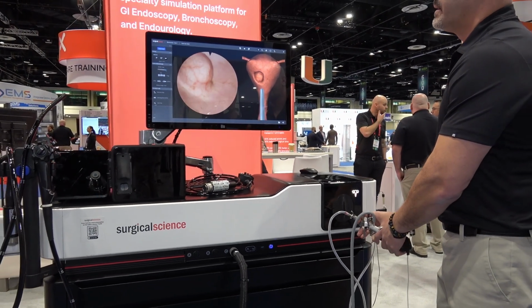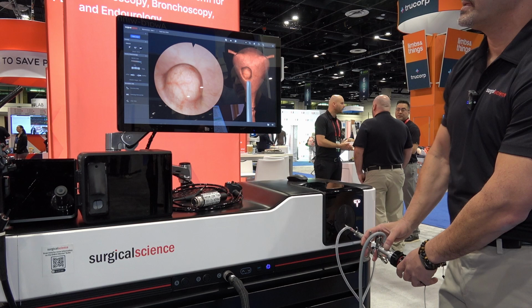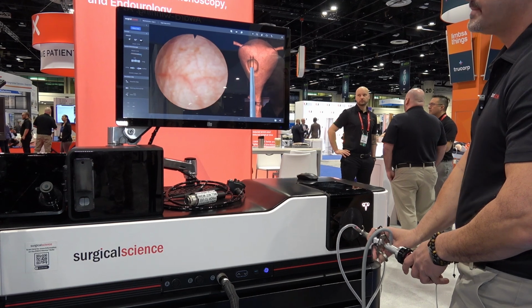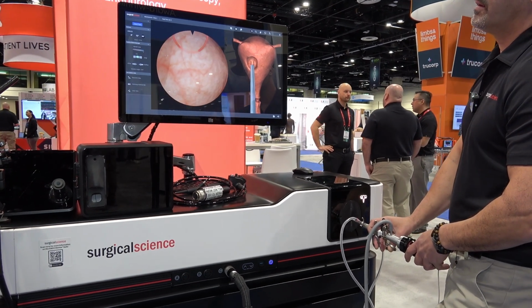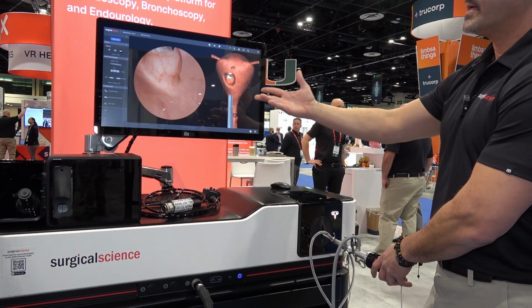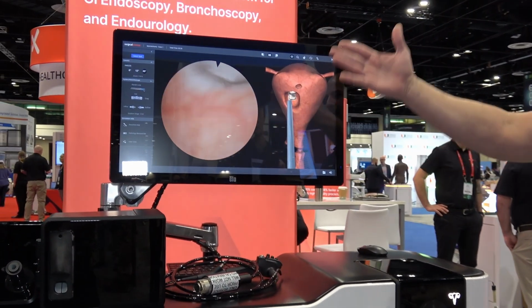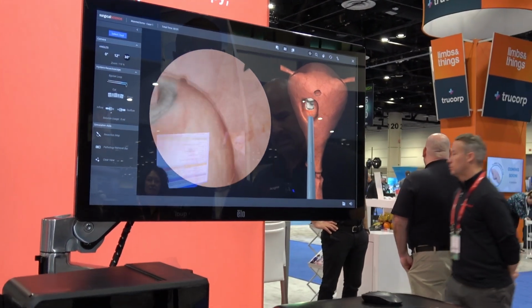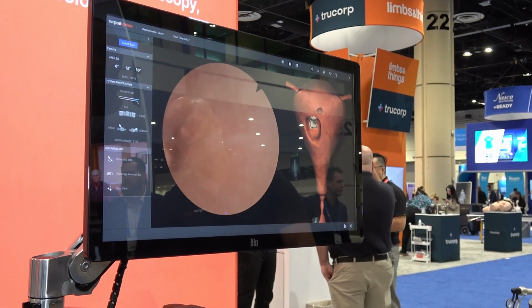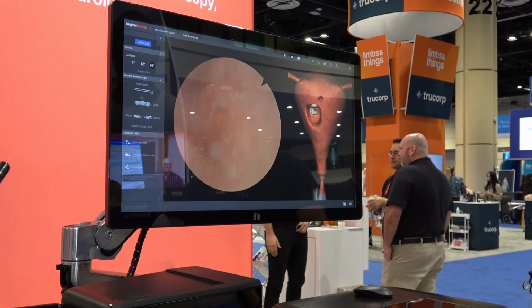What we see here is a very nice example of a very, very complex case. This is a myomectomy case where there is a very big benign tumor that we have to resect very, very slowly by using what we call a resectoscope. And just like in real life, it creates bleeders and complications that need to be monitored very closely. There are a lot of technical functionalities, like changing the camera angulation, and a very important feature: if you look at the screen, you see the inlet and outlet valves moving. This is how the doctor controls the fluid management inside the system. Otherwise, it can create a lot of complications and pressure.